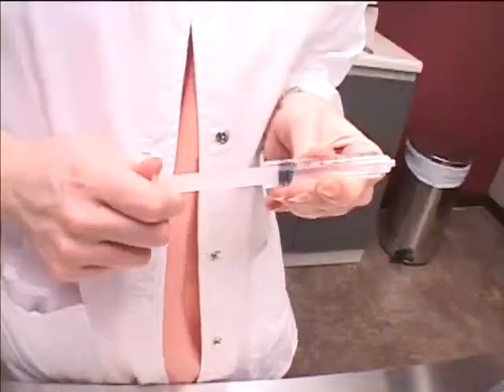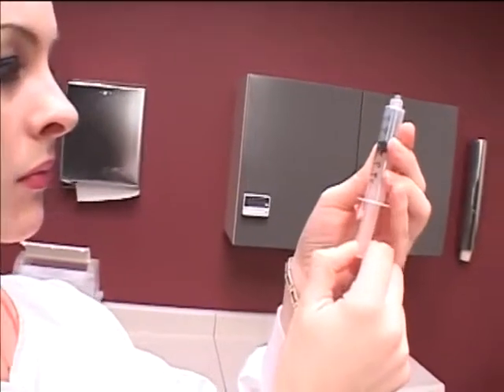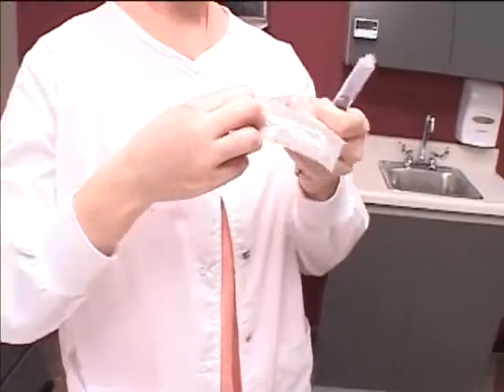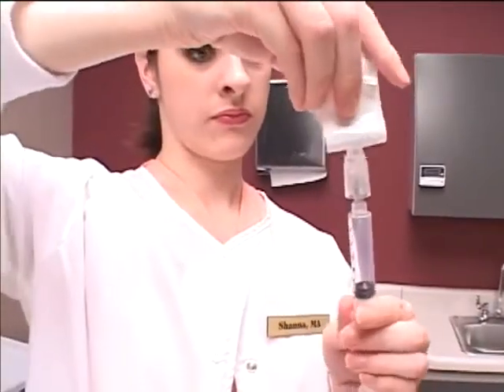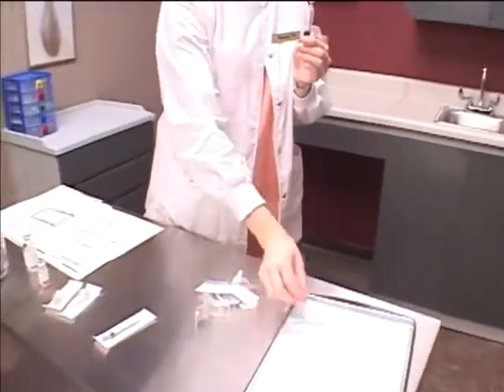Open the syringe and loosen the barrel by gently moving the plunger back and forth. Holding the syringe at eye level, withdraw an amount of air equal to the amount of diluent to be withdrawn. Open the needle and attach it to the syringe. Uncap the needle and place it on a clean surface.